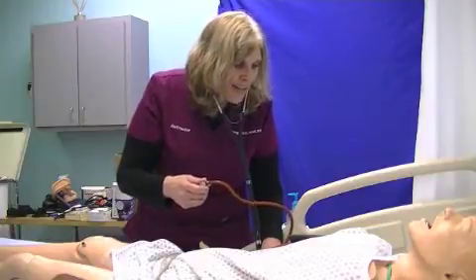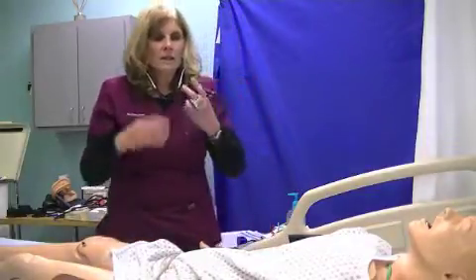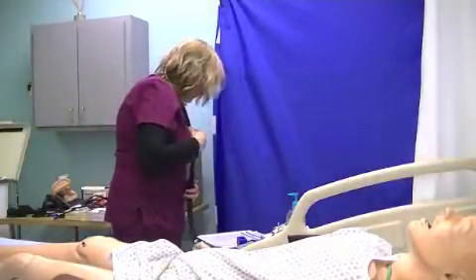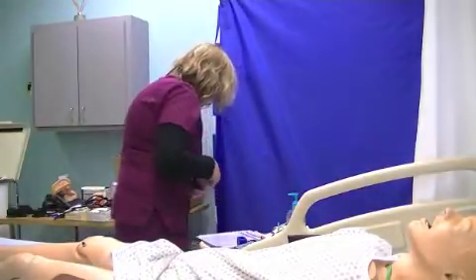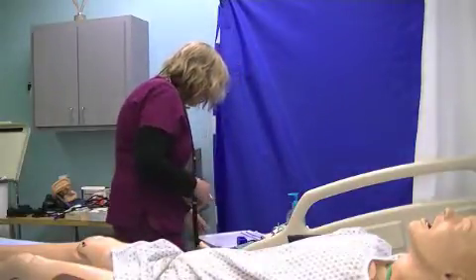Then all of a sudden it goes silent. The last sound heard is a diastolic, that's when the heart's at rest. So I got 110/60. I'm going to make sure I didn't get any clothing in there.